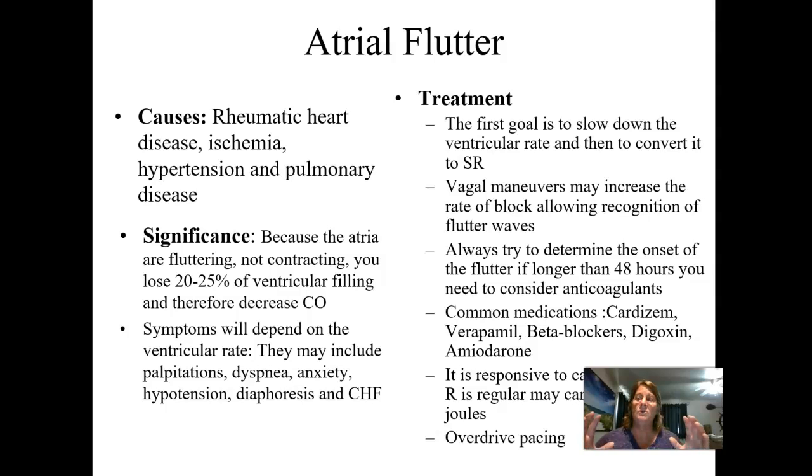When we turn on our defibrillator and set our energy selection, we also have to hit the sync button. We want this to fire on the QRS complex, not on the downslope of the T wave, which can make things even worse. Because our patient is in an atrial flutter, and it is usually so responsive to cardioversion, we can usually start off with fewer joules. 50 or 100 joules is a lot of times enough for an atrial flutter for cardioversion.